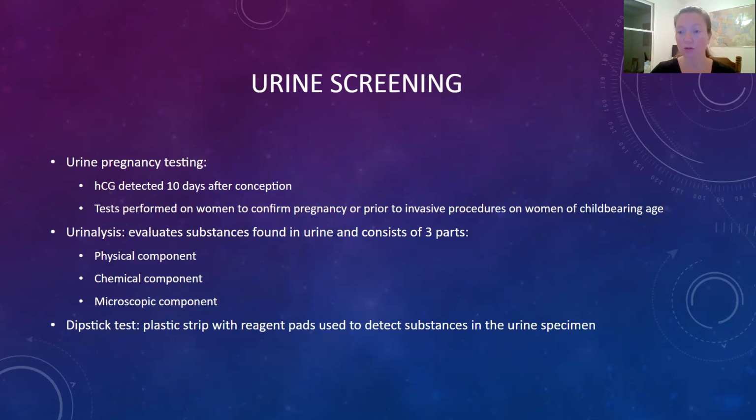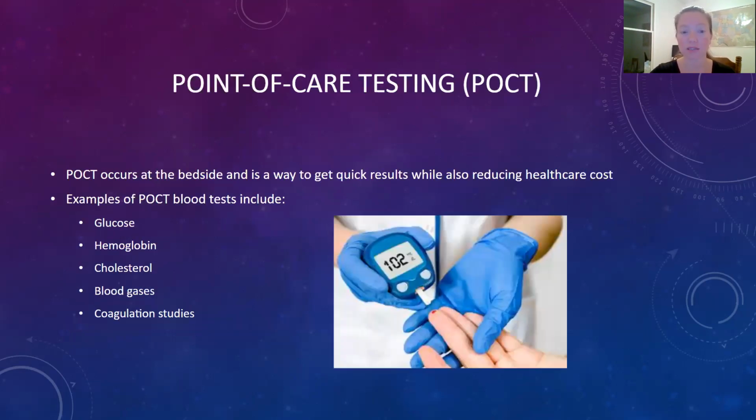So you want to make sure when you're doing a urinalysis that you're reading those reagent strips, or those test strips, at the appropriate time, and make sure you go by the manufacturer's recommendations for how long they need those strips to sit before you actually read them against the control. Competency number 15-2 on page 418 in your textbook is going to give you a nice step-by-step procedure for a urine chemical screening. Let's finally talk about point of care testing.